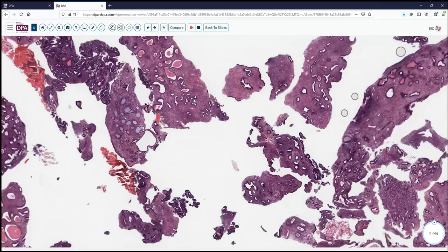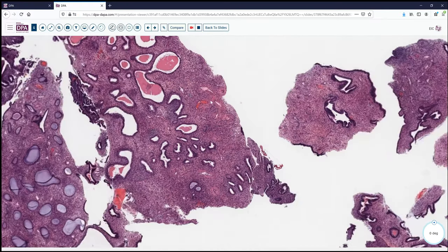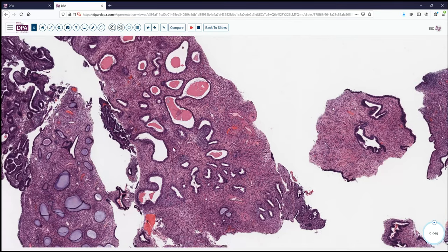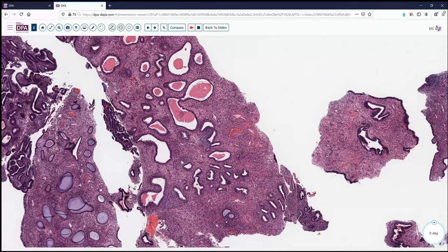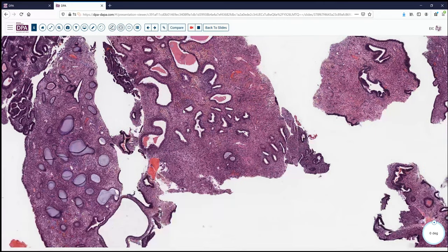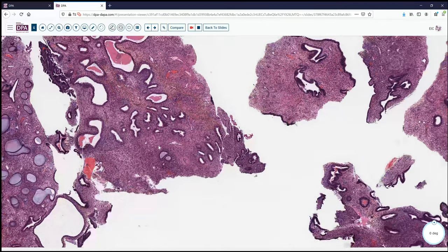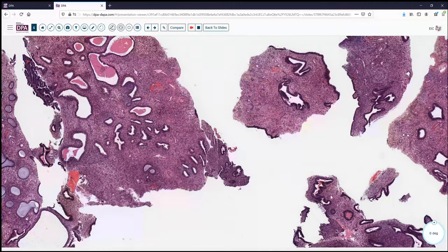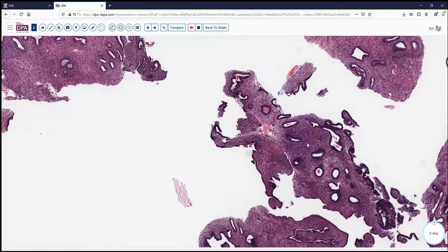So we probably are dealing with a polyp. Here we have more evidence of that — these nice thick-walled blood vessels, angulated, variably dilated, and scattered glands of varying sizes. If we had just this kind of material, this would be ideal for a postmenopausal polyp, with a little bit of stromal atrophy and so forth.